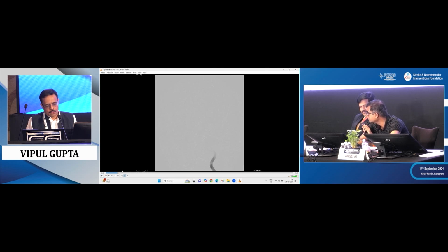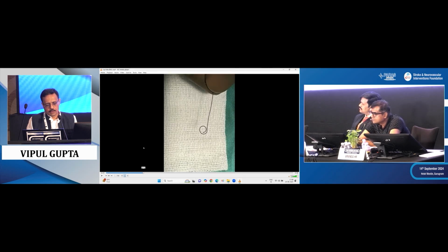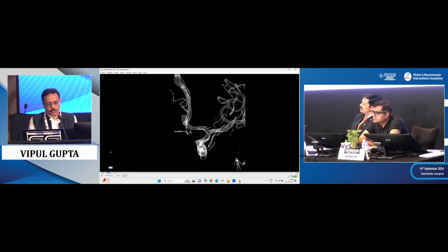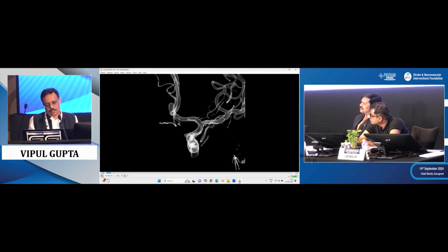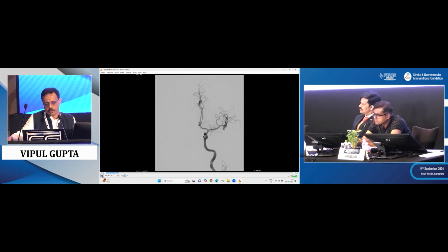Yeah, and another thing is, if you go back, if you see in this plane, when they are inferiorly pointing, the microcatheter points very well and you can pack them hard. When they're superiorly pointing, the microcatheter tends to back out at times, and then you're stuck with it, right? So I really wanted to pack it at the neck pretty hard, and as I said, most of these cases nowadays we just use a balloon because it is so convenient, and only in very few cases with severe spasm or something like that will we do without a balloon.